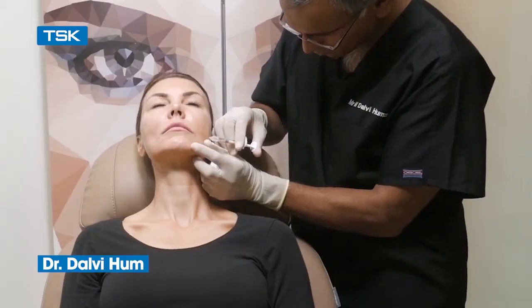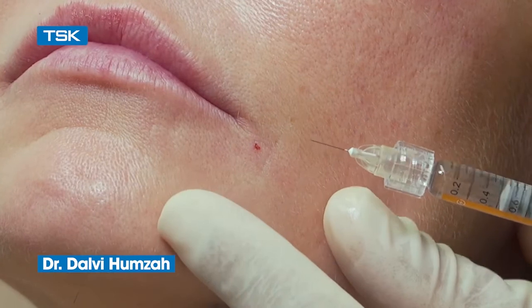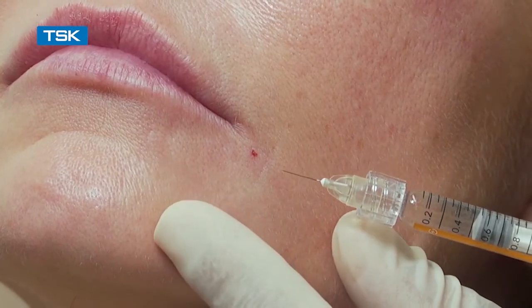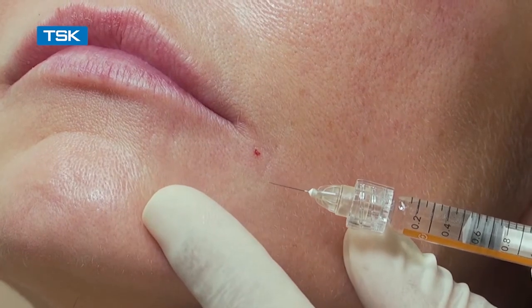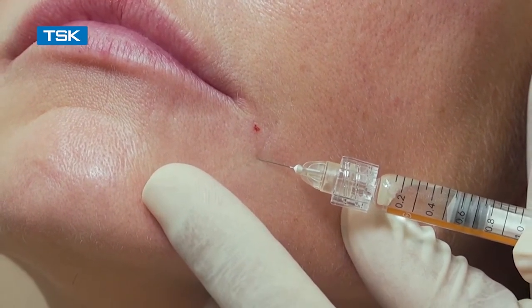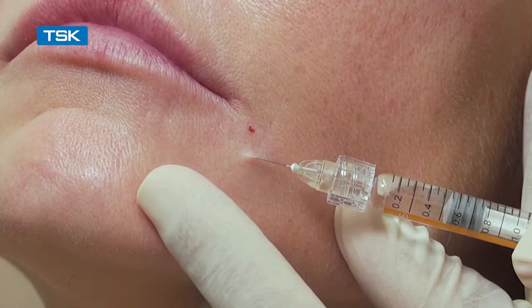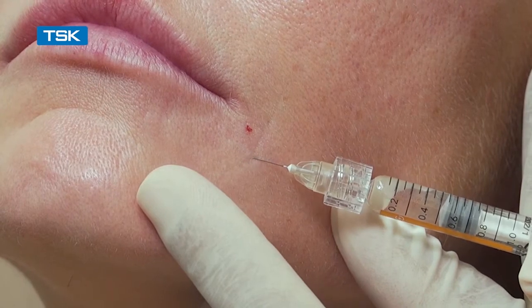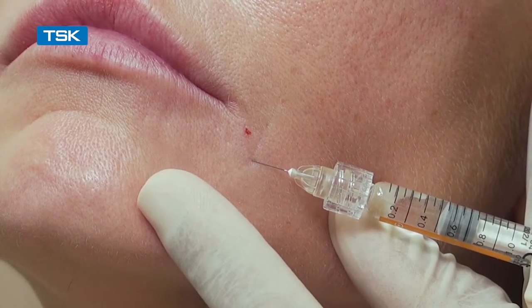We are now going to use a special technique of using an invisible needle to introduce filler intradermally to do what is called a superficial blanching technique. The skin is stretched, the needle is inserted just under the skin, and because it is an invisible needle and quite flexible, it allows the needle tip to stay intradermally. The blanching is then done by firm pressure.